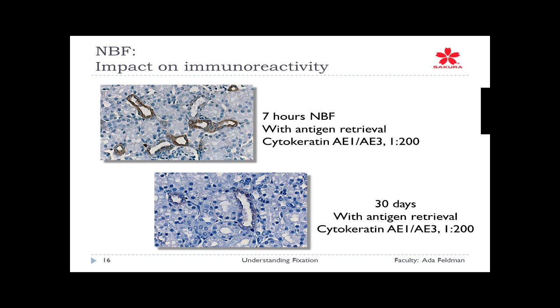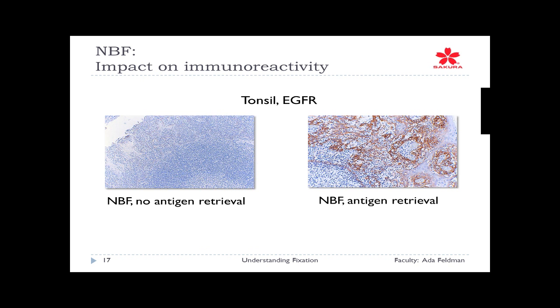It's very weak, but the reason why is because this slide, and I know this is not normal, but for those of you in vet research, this was fixed for 30 days, a month. Such an excessive amount of cross-linking has occurred that the standard amount of antigen retrieval was unable to demonstrate the cytokeratin.